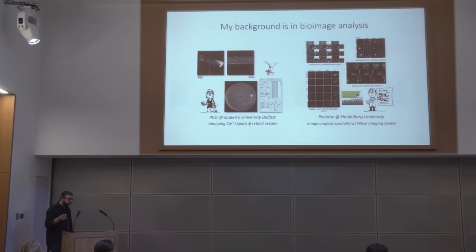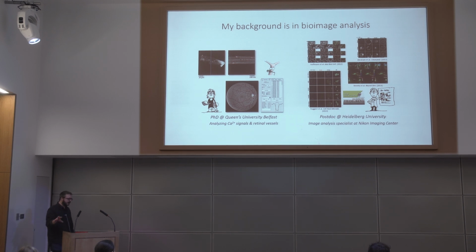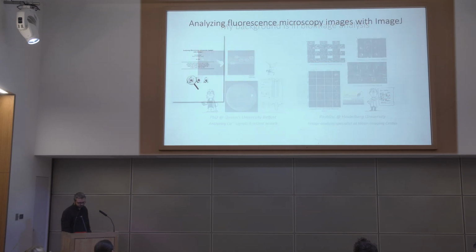And then after that, I moved to Heidelberg University, where I worked at a core microscopy facility. And there, I started off trying to treat every project as a research project and spent a long time developing an algorithm. And I realized that wasn't going to make the people using the microscopes in the facility very happy, because what we needed is faster solutions that answered the precise questions that they wanted to address. And this is what really pushed me slightly away from pure algorithm development and a bit more into the open source software and using things like Fiji and so on to be able to try and create a customized analysis pipeline for specific applications as rapidly as possible.